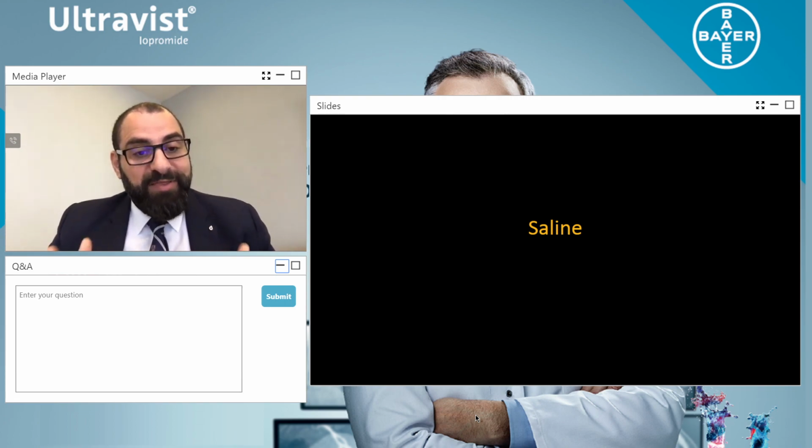More importantly, with that extra saline in the interstitial space or within the actual blood volume, then the actual saline will get into the kidney a lot faster. So it's going to increase the dilution of contrast in there. And then more importantly, when you actually have this much of saline that goes through, which is not a lot, then you go to the toilet for excretion a lot faster.